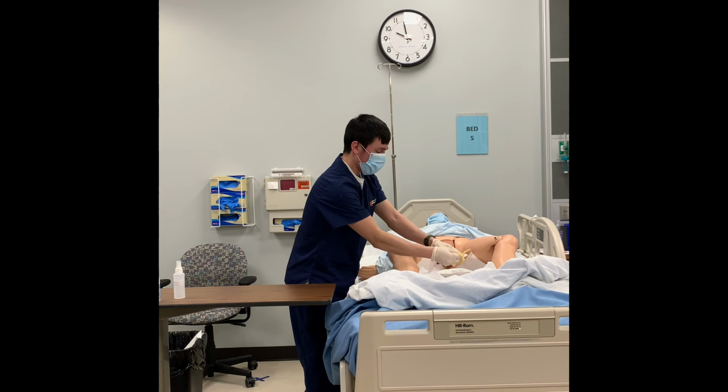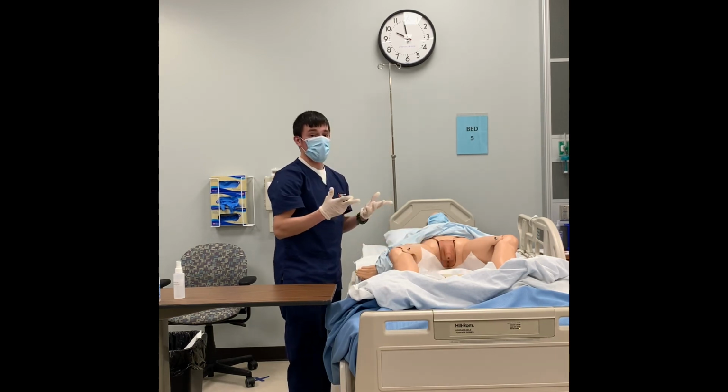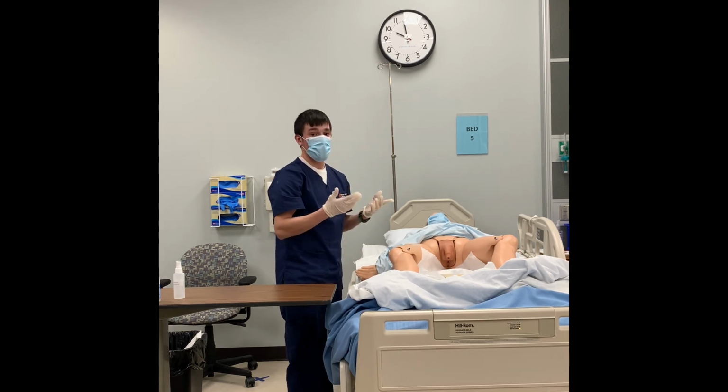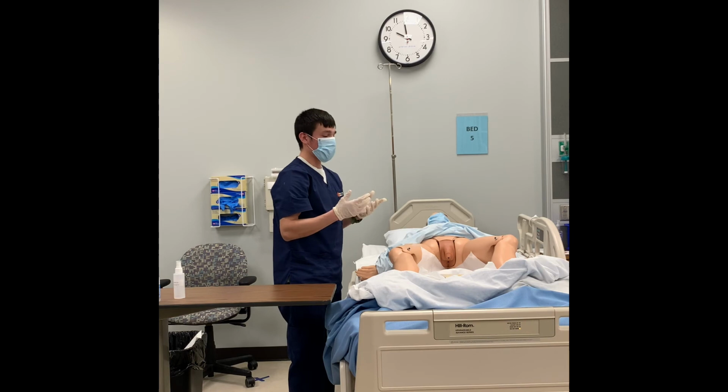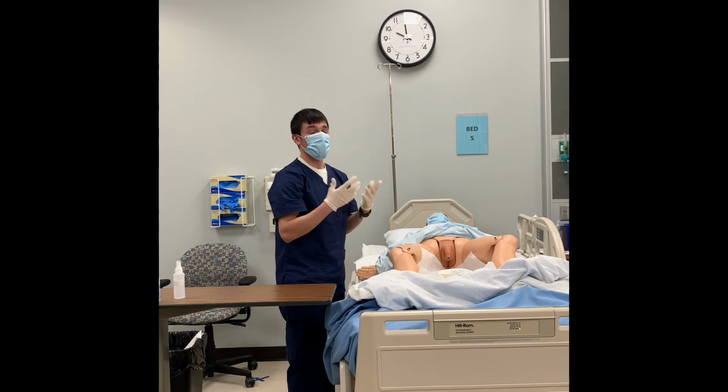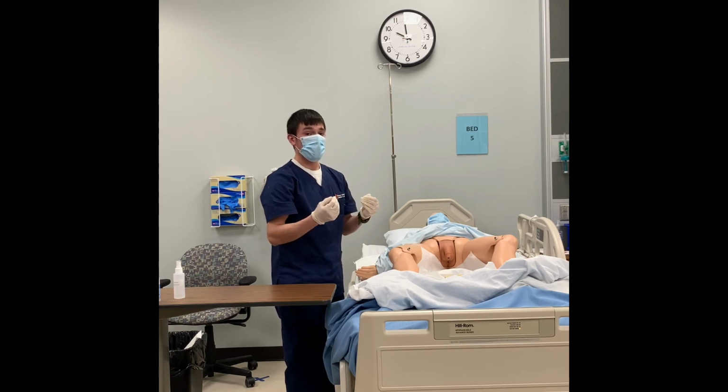After we discard it, I would do the same procedure as before. We would clean everything up, make sure that he doesn't have any discomfort, address any issues or problems that he may have, cover him back up, and put the blanket back up, give him his call light, perform hand hygiene, leave, and document.